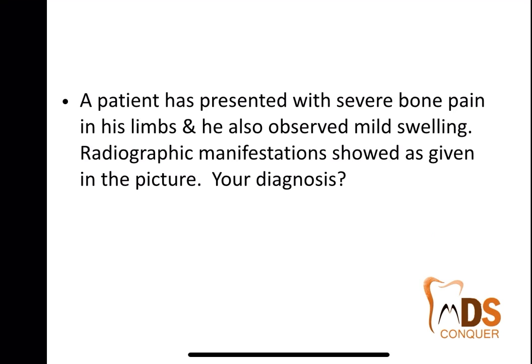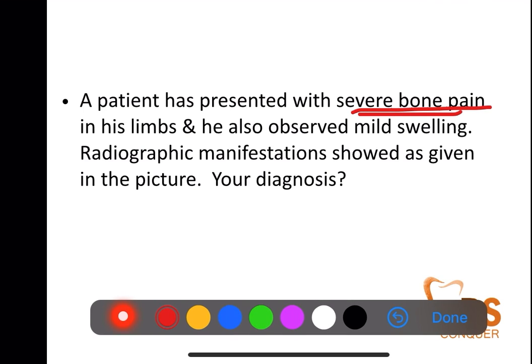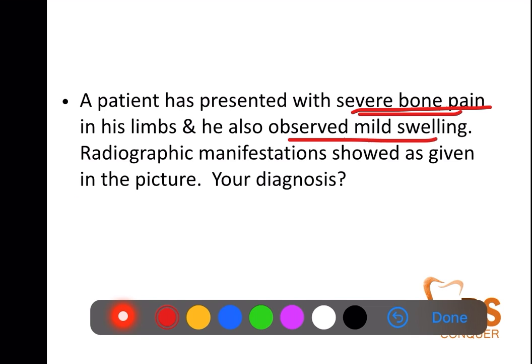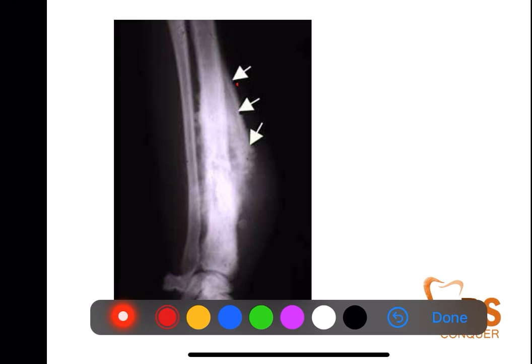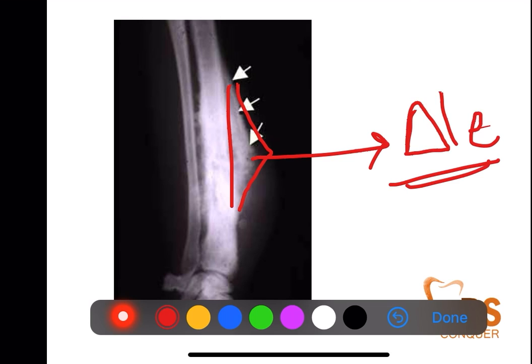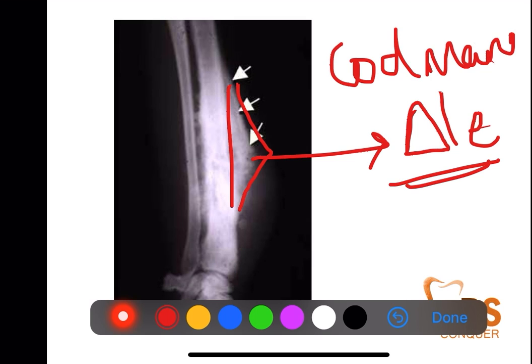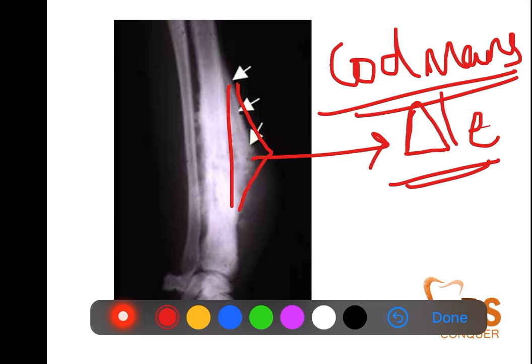Next case: a patient has developed severe bone pain in the limbs, complaining the pain is within the bone, along with mild swelling. The radiograph shows elevation of the periosteum giving a triangle appearance — this is the Codman's triangle. If such a presentation of a long bone is given with elevated periosteum forming the Codman's triangle appearance, blindly go for osteosarcoma. Osteosarcoma has the Codman's triangle appearance of the long bones.